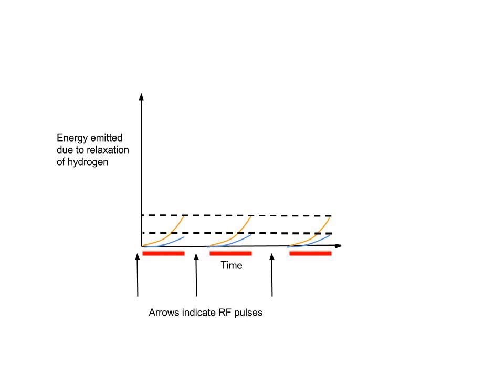And now, because we terminated relaxation early, if we draw our dashed lines across to meet the y-axis, we can see that different amounts of energy get received in the coil from the two tissue types. So if orange tissue type was at voxel X10, Y10, Z11, and blue tissue type was next door at X10, Y10, Z9, say, then we would now be able to distinguish them from each other.